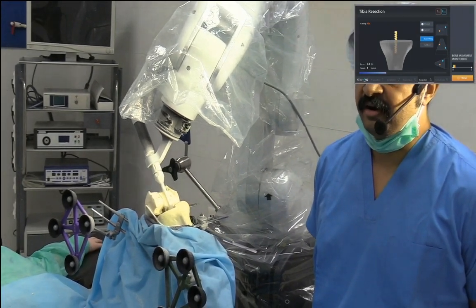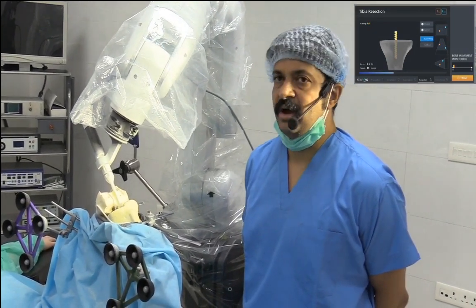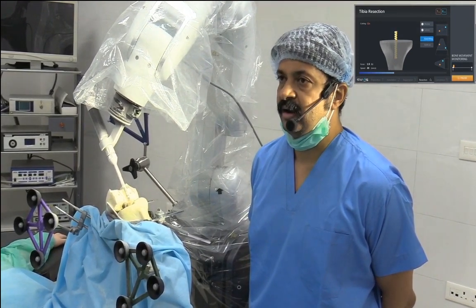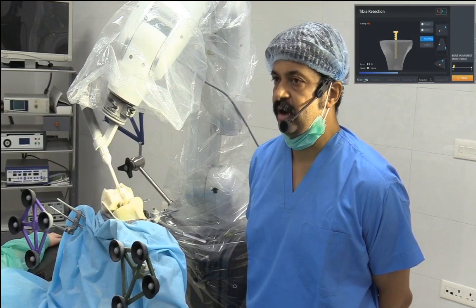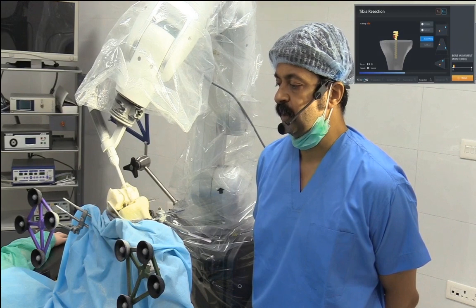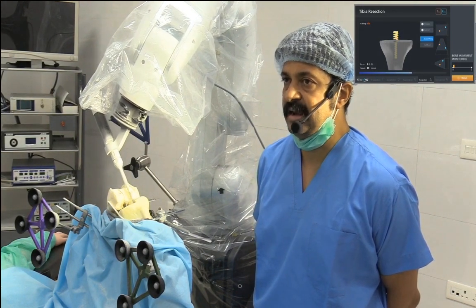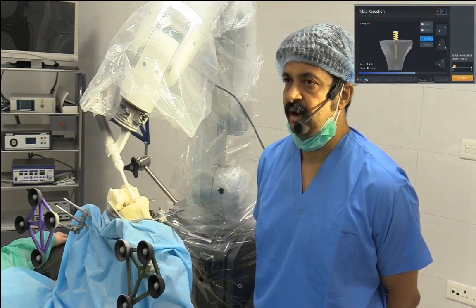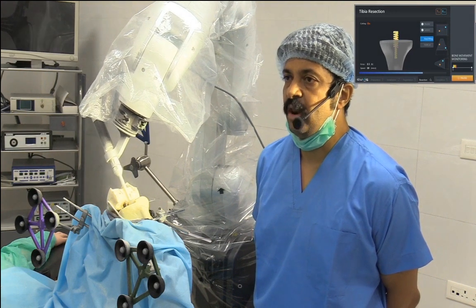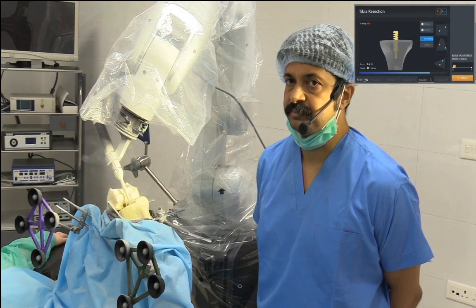As you can appreciate, in real time, how the tool is advancing within the tibia to make the keel hole, and now is the time it is going to create the keel wing after creating a circular hole. So right now the preparation of the keel is in progress, and after that it will also create the wings, and this all happens as per the rotation that we have set pre-operatively.